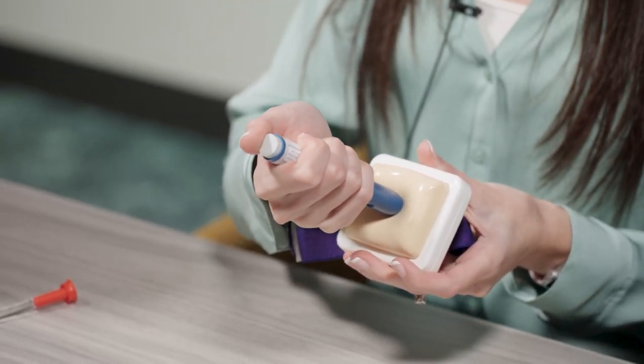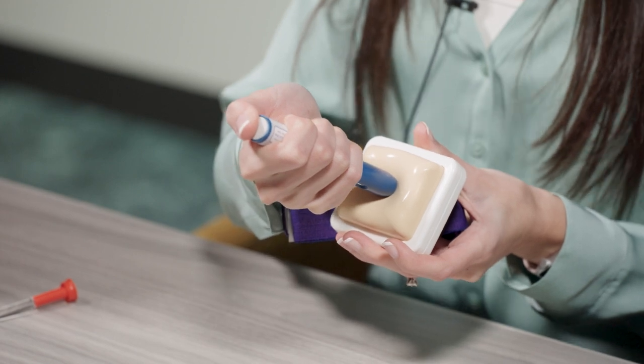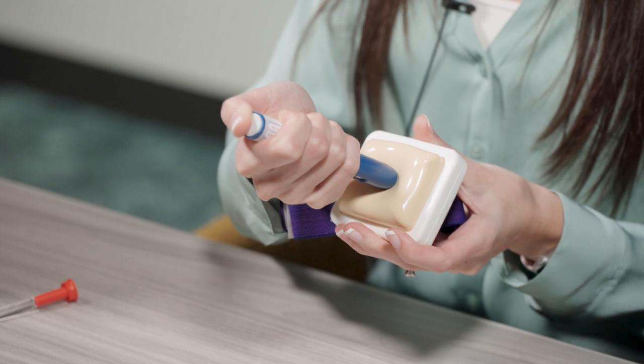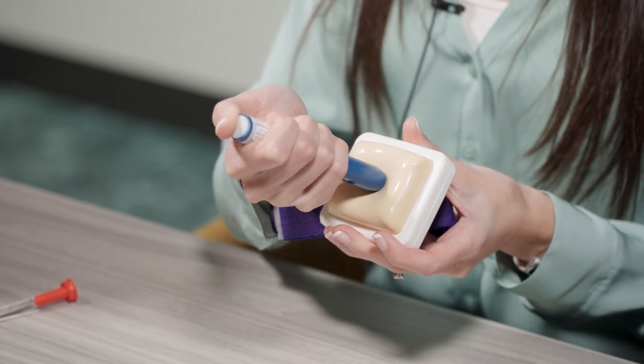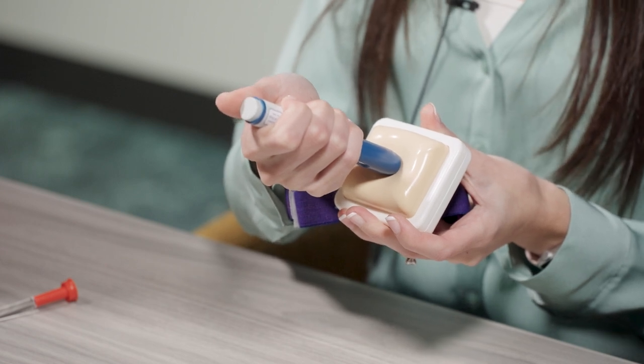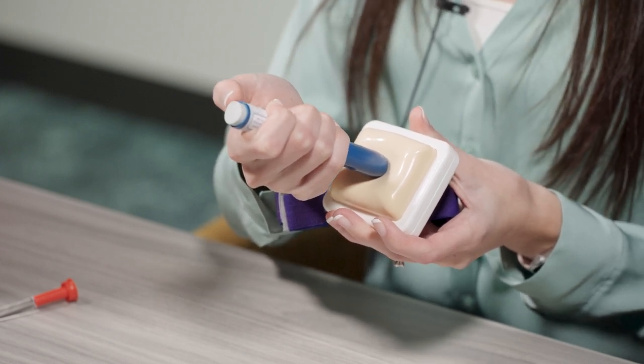Next, press the gray start button. You'll hear a click. Keep pushing the pen down on the skin, then lift your thumb off of the gray button. The injection could take about 15 seconds. The injection is complete once the window is fully yellow. You may also hear a second click.